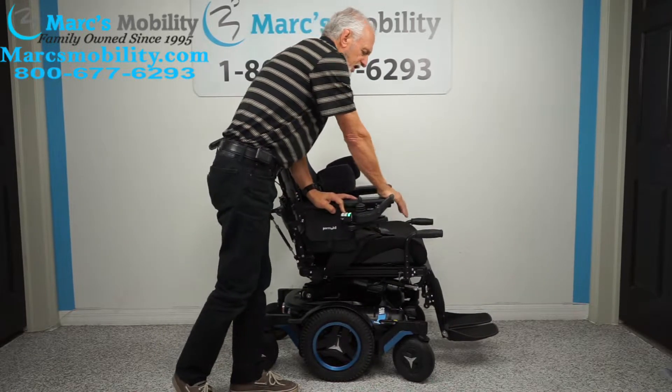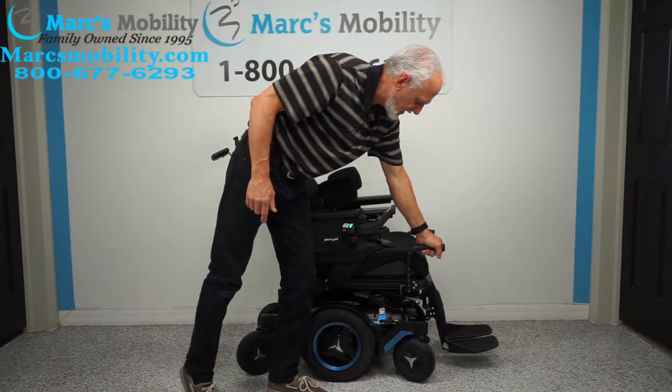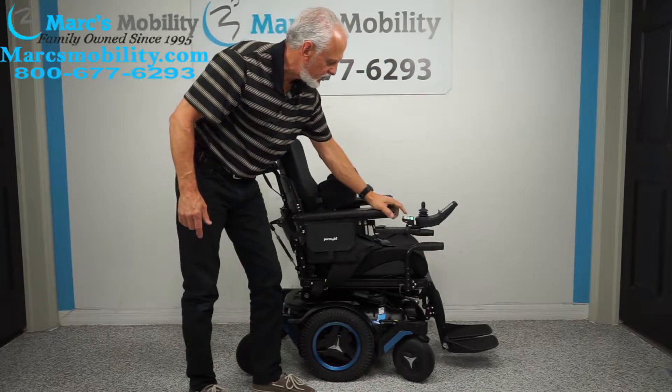The swing-away is also really useful when you leave the chair — you're not pushing on the joystick and you can push off the arms. This chair has push bars, so when you leave the chair you can use these to push off. There's one on each side.